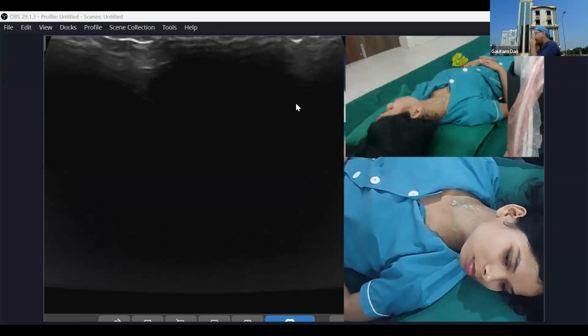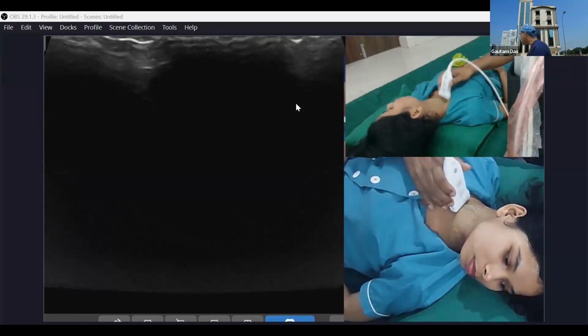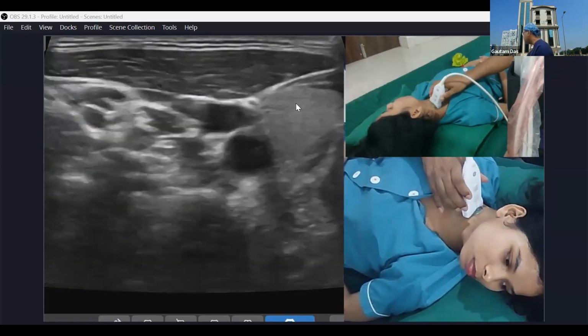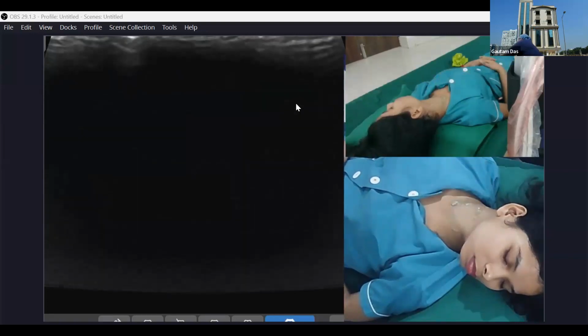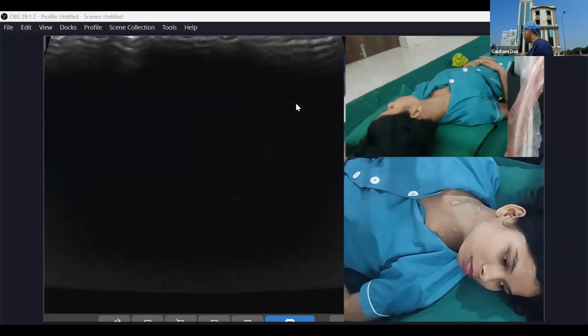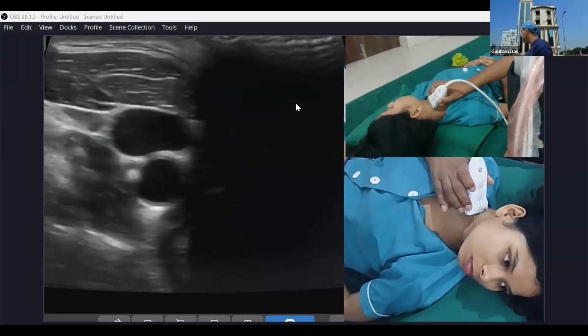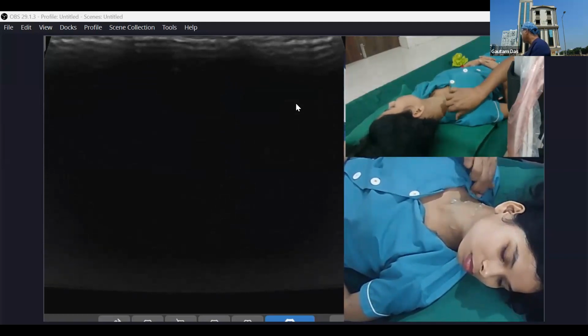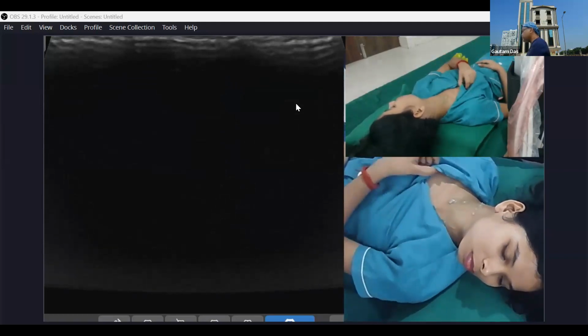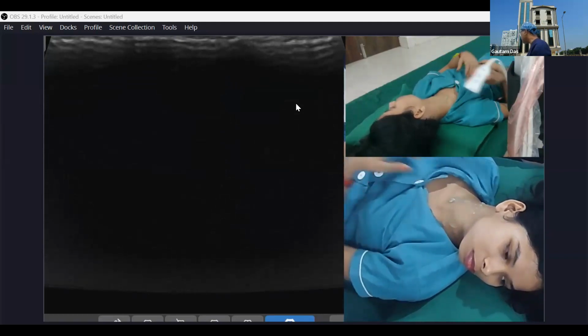Okay. Nothing? Let me go to the lateral neck. Lateral side, very important is the superficial cervical plexus, and I'll be showing you the greater auricular nerve there. So again, where to search? So we have to search the posterior border of the sternocleidomastoid muscle.